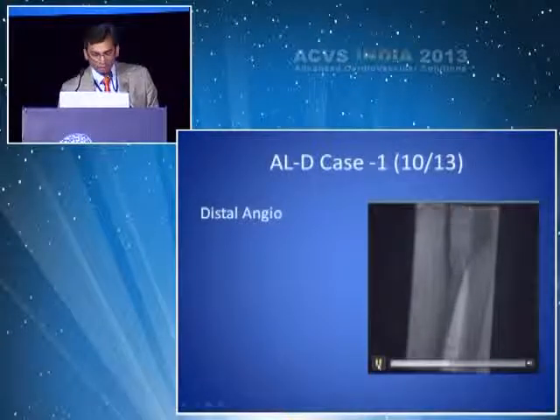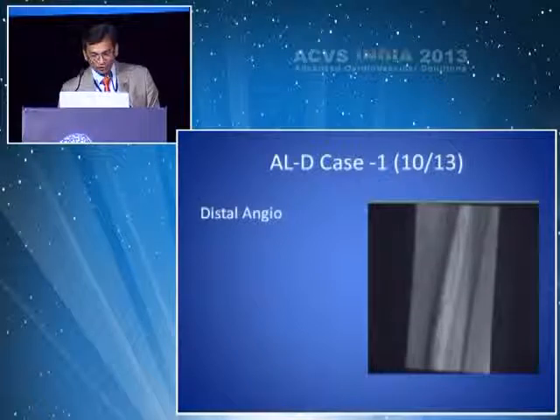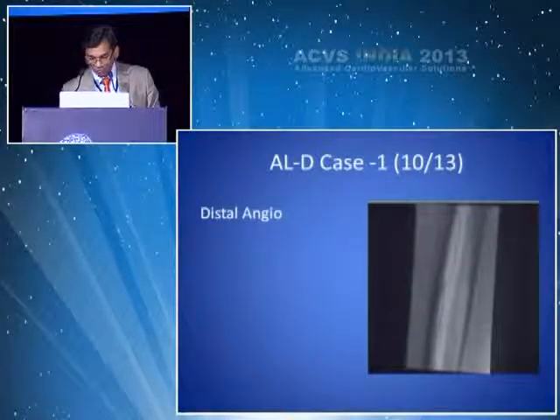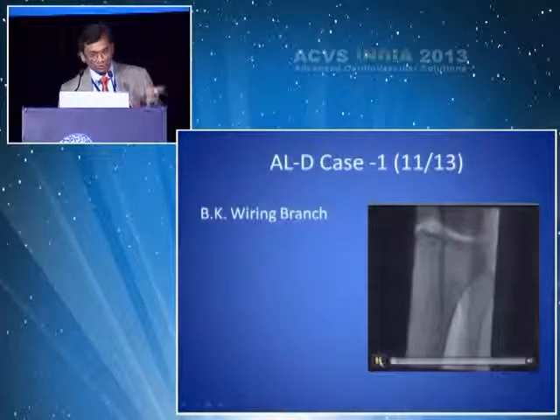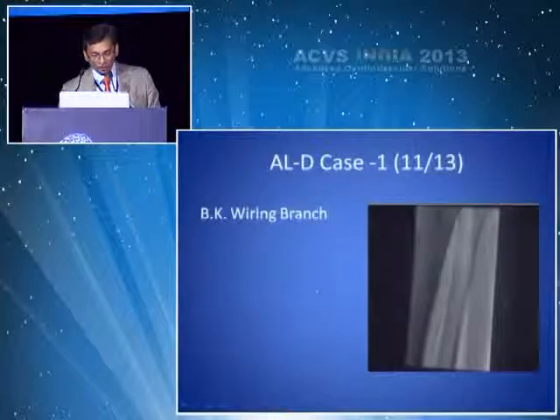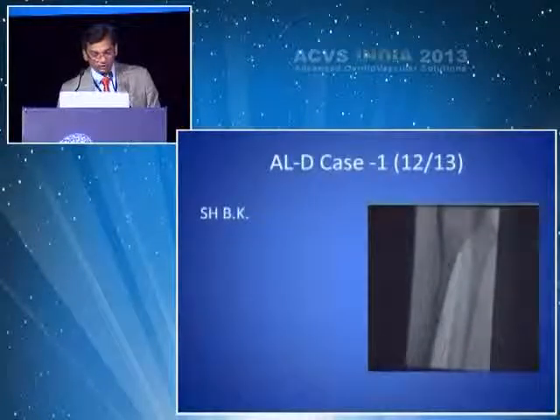Popliteal looks good, that's after primary atherectomy, no ballooning. It's distal disease now, which we need to tackle. As you can see, the runoff is still very poor, and he came with a cold foot. Then we wired it, it's a long total occlusion that hooks up with a collateral. Wired the collateral, you can park your wire in the collateral and have some room to pass the Silverhawk.